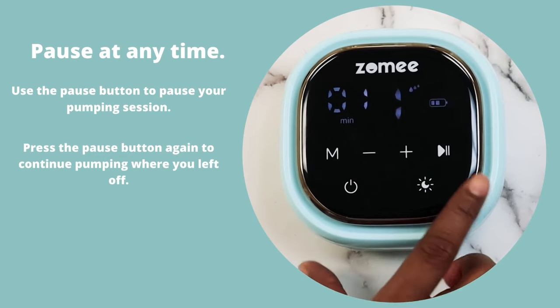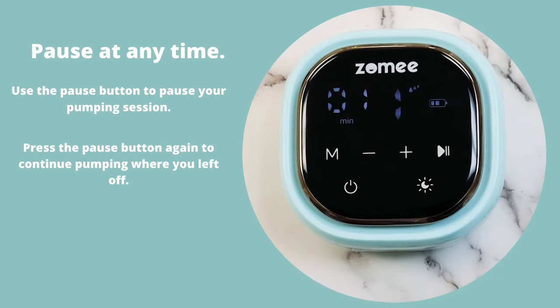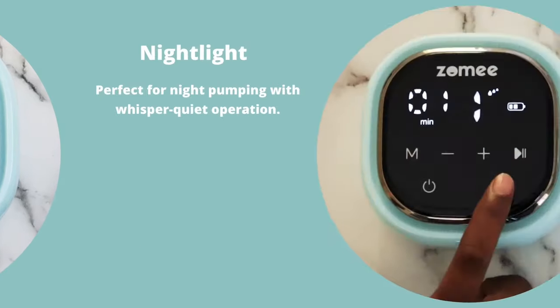You can pause at any time. Use the pause button to pause your pumping session. Press the pause button again to continue pumping where you left off.